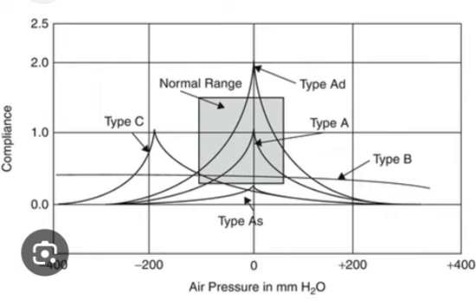In evaluating hearing loss, tympanometry permits a distinction between sensorineural and conductive hearing loss, when evaluation is not apparent via Weber and Rinne testing. Furthermore, in a primary care setting, tympanometry can be helpful in making the diagnosis of otitis media by demonstrating the presence of fluid buildup in the middle ear cavity.